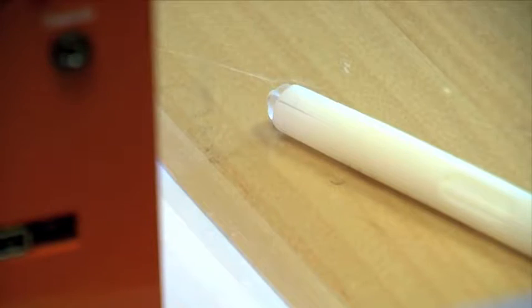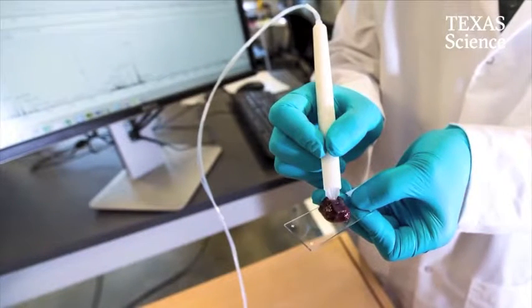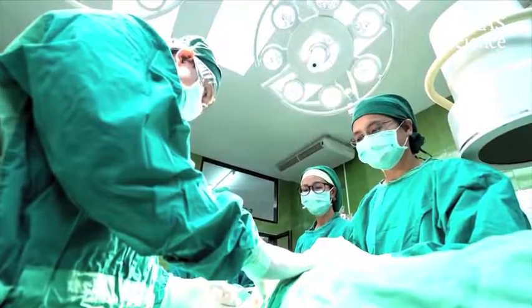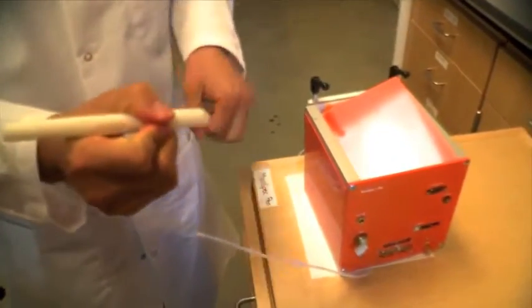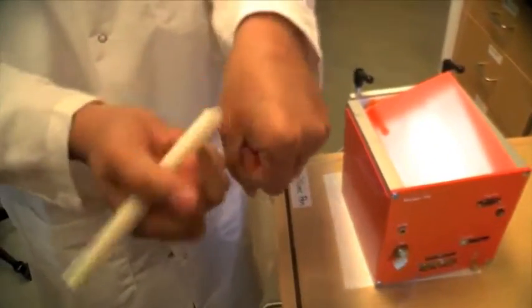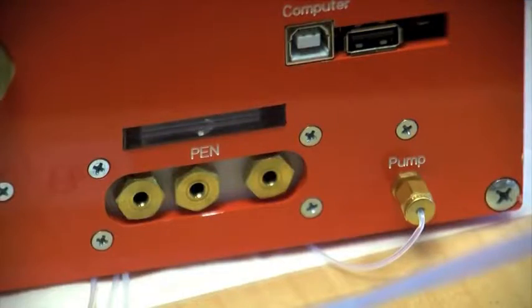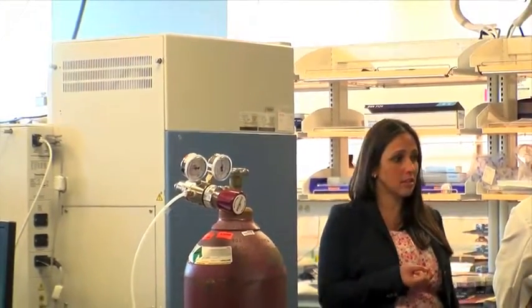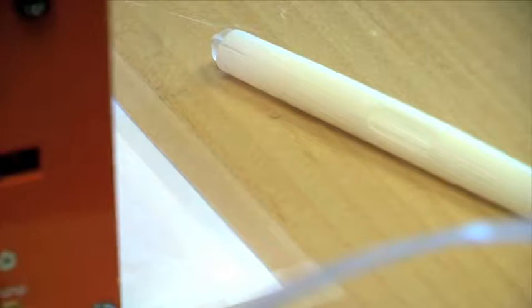Prior to the pen, sending tissue for testing during surgery could take upwards of half an hour, increasing the risk. The surgeon has to wait there and the patient is open, so there's complications from that. So we will just hold this pen and touch on a tissue like skin. Eberlin and a team of about 15 others started developing the pen 2 years ago. So far, they've tested it in 253 human tissue samples with a 96% accuracy rate.